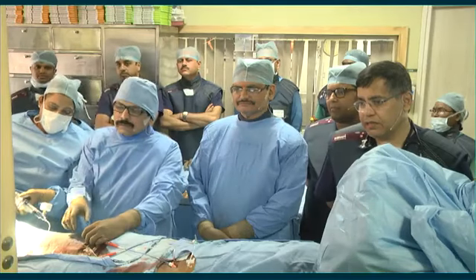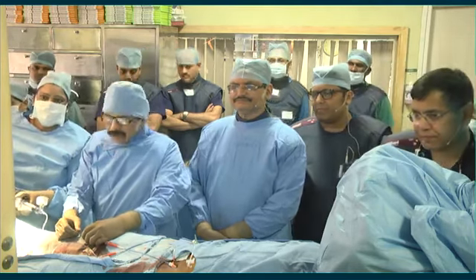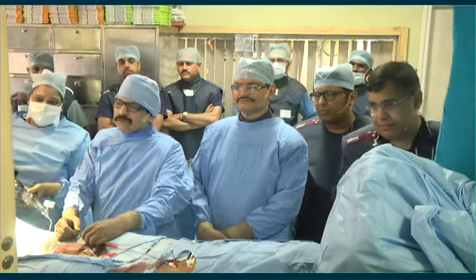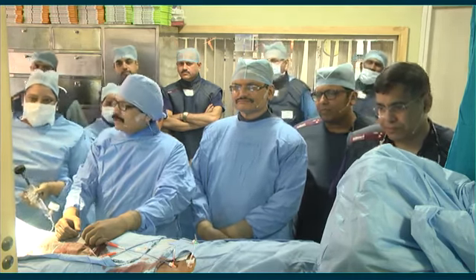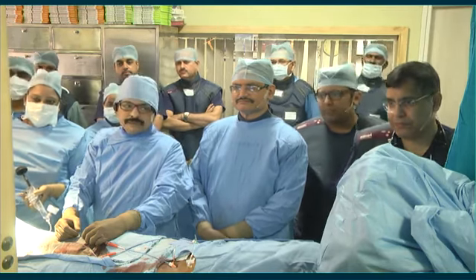So with that, I'm going to hand over to Dr. Suryaprakash, who is our mentor and leads the CTO. Good afternoon. First of all, my gratitude to Dr. Tamam and the IMC organizers for giving us this opportunity. It's a festival day here, in spite of that, all my team members and the staff assembled for the CTO live demonstration case.